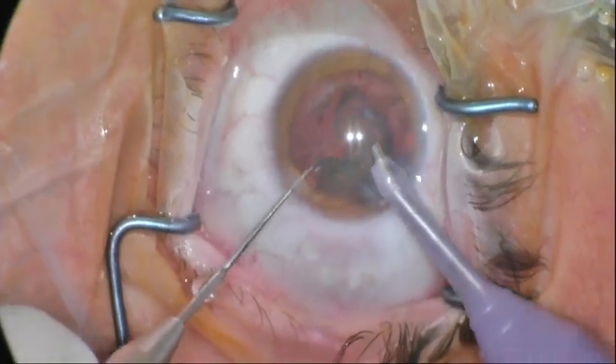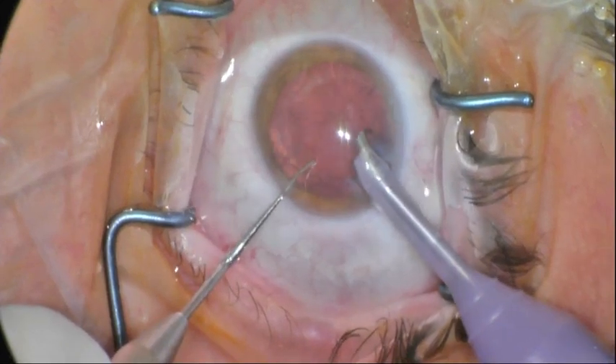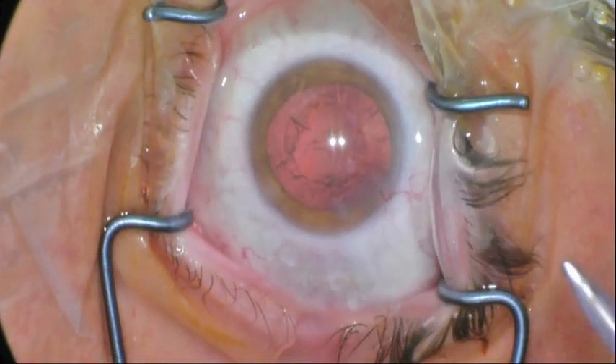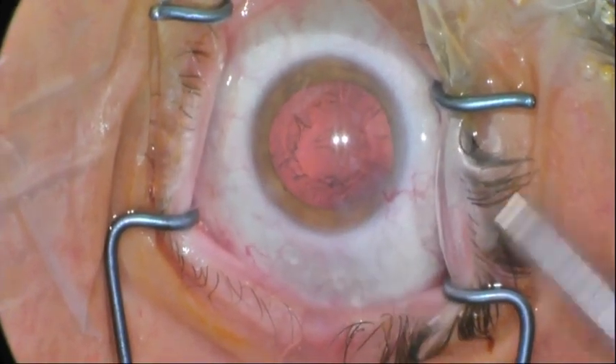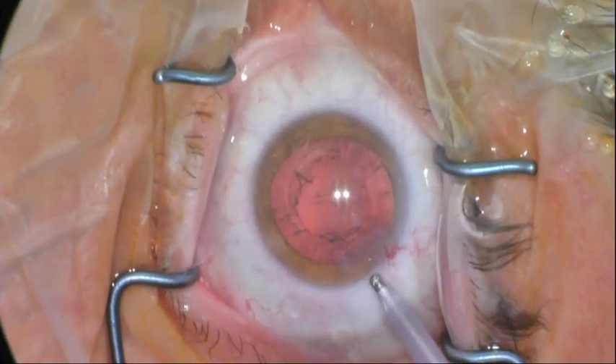At this point, we haven't put any grooving, sculpting, lens cracking, or any pressure on the posterior capsule. We can proceed then with the irrigation and aspiration of the cortical material, and then lens insertion as per normal.